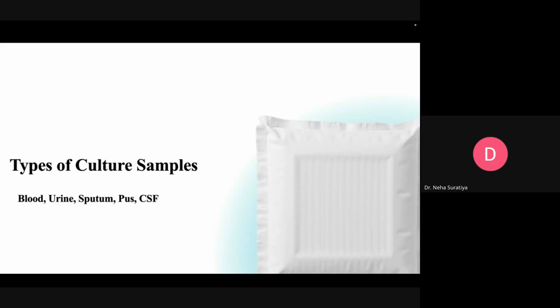सबसे पहले क्या चीज होगा? You need to collect the sample. So we have a special team for it. Sample can be blood culture. Blood culture sample किसमें use होता है? So it is used in cases of sepsis, bacteremia, and it must be taken before antibiotics, and it requires adequate volume of the blood as well, right?